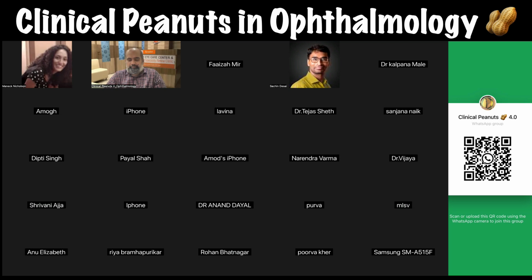So I don't think anything lower than 1 would actually require a toric lens, in my understanding. You can correct it easily with an LRI or maybe, as we mentioned earlier, your corneal incision directly, though it might not completely correct.